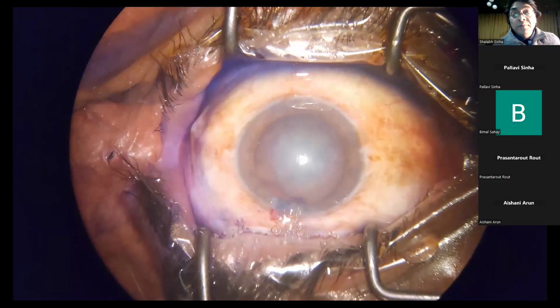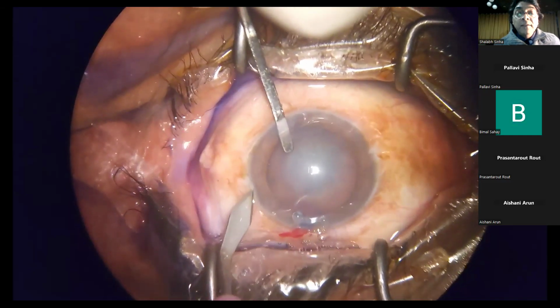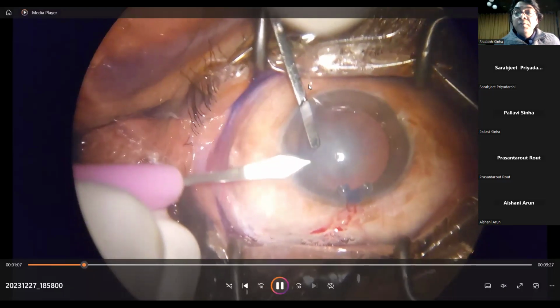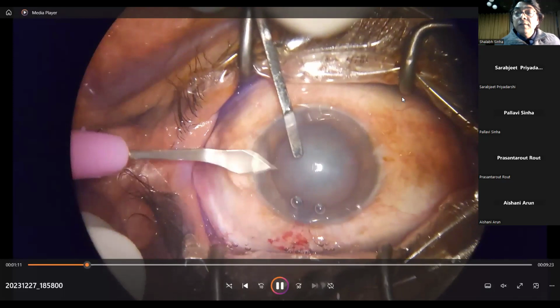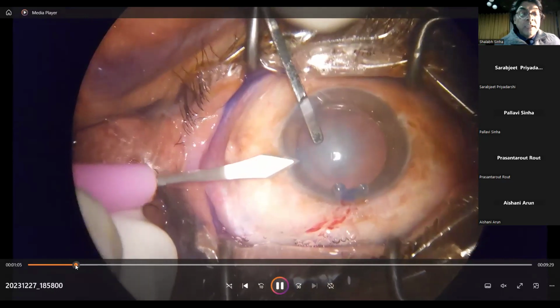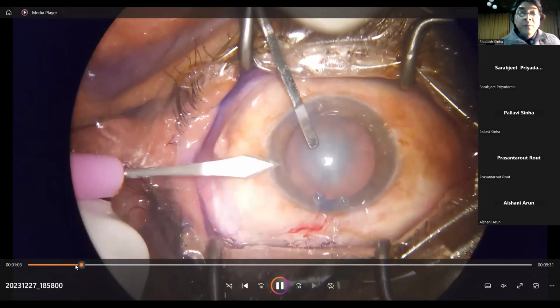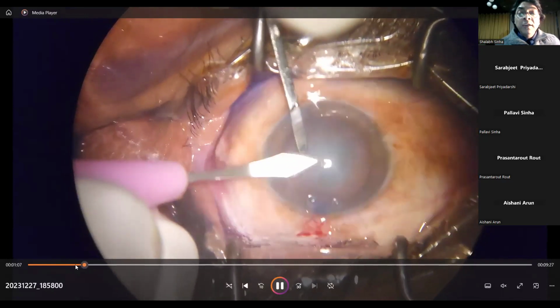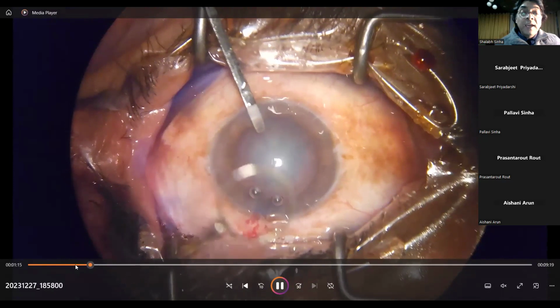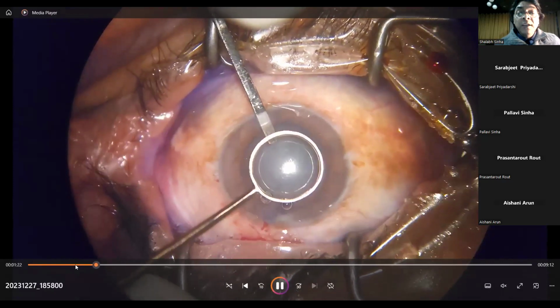And then you take your viscoelastic, go to the opposite end of the eye, and then once you've made your groove, so I will show this again. What I did was that I made a groove in the area of where the incision is going to be placed. And then within that groove, I went inside the cornea and then just the keratome goes inside and slightly enlarges the incision. This is a 2.2 keratome. The incision has been enlarged to a 2.4.